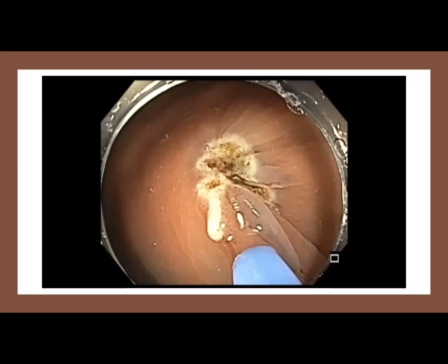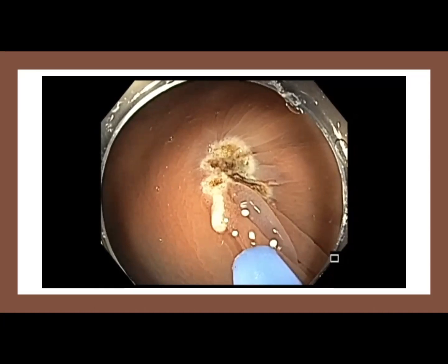In a case like this, where there is tethering from previous resection, there is already complete obliteration of the submucosa from scarring. And in that case, when you apply APC, this doesn't look good. This doesn't look too bad. But if you leave it open, there is a possibility for delayed perforation.